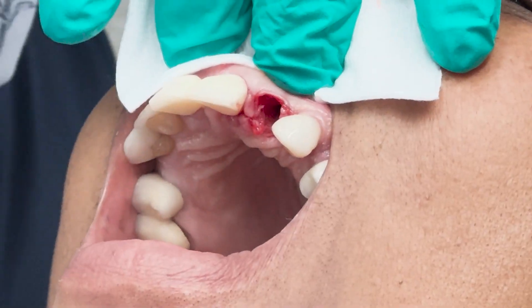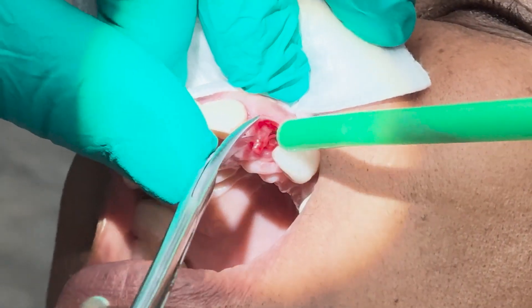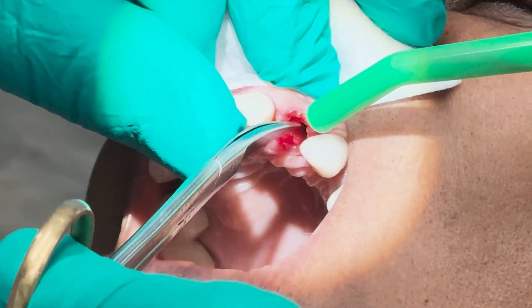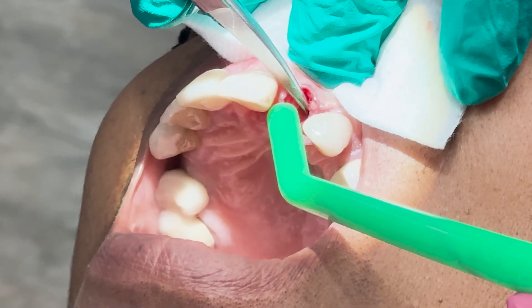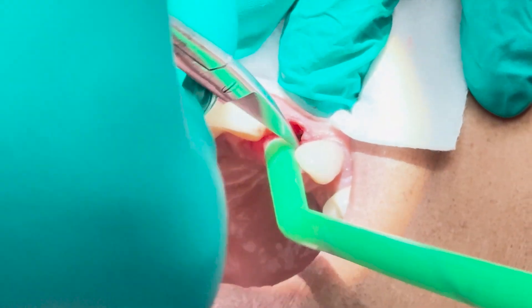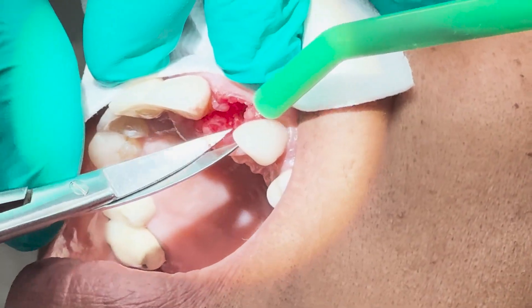For those of you who have seen me do these, you know I like to get rid of any of the infected tissue around the root. It just helps it heal quicker and better when you do that. So I'm going to get rid of all that granulation tissue.